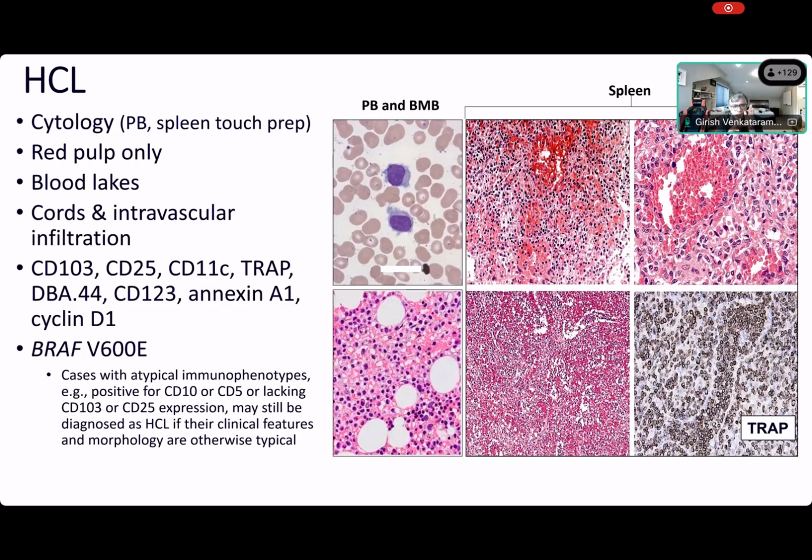And if you do IHCs, the useful IHC, again, I will say, is not necessarily the big list, but rather very few like CD20. Start with CD20, do a cyclin D1, right? And annexin, people usually don't have frequently, but CD25 is probably important, so do a CD25, right? Or send your CD25 out if you don't have it in house. It's good to send out CD25. All the other stains are kind of just a cherry on the cake, right? Annexin A1 is supposed to be good, but it's not an easy stain to get to work.